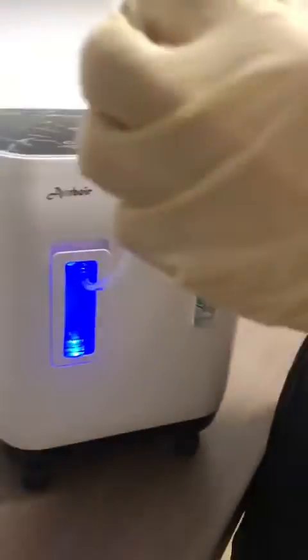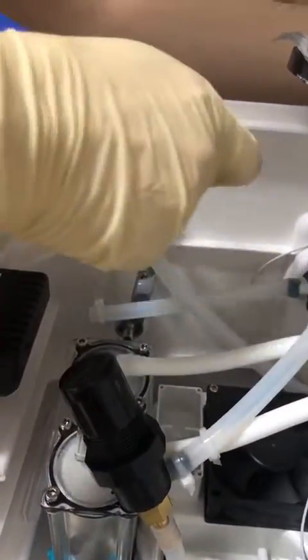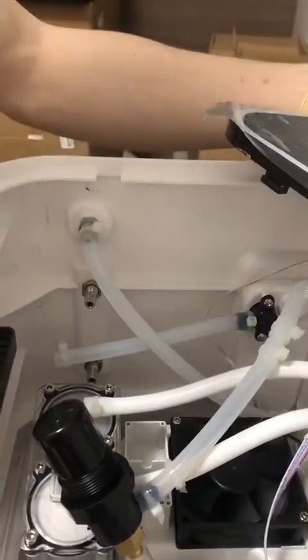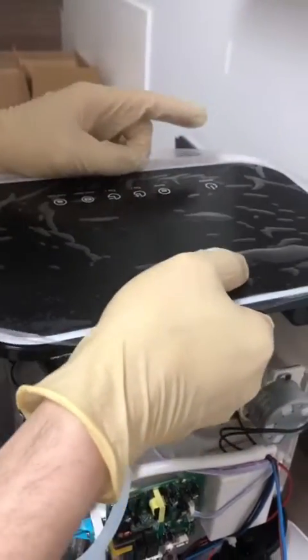Like this, right? Now hold it. Okay, this one. Now hold it. Put the tube back. Okay, and now we put the tube back. Okay, and then we'll install the machine. Let's put the tube back.